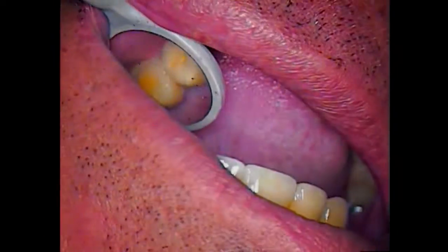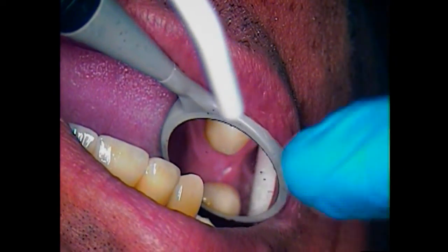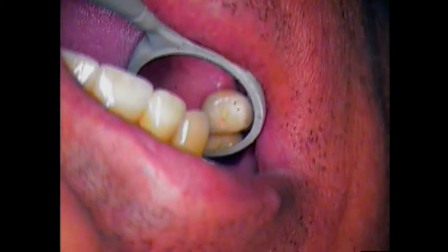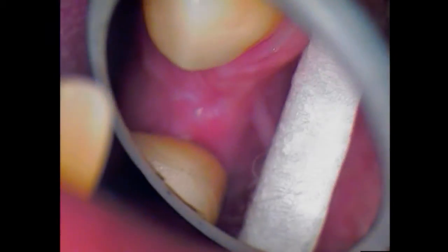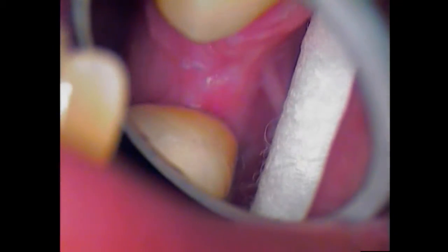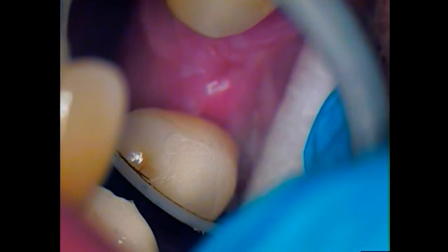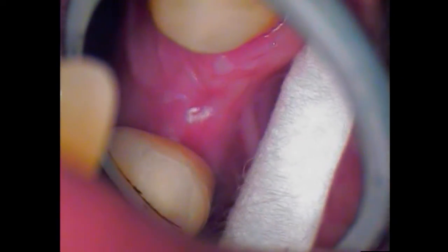We're looking right now to check relationships between the right and left sides of the mouth proportionally. Keep in mind we're going to have to gain access through the soft tissue and be very careful to identify the exact position where the implant is, conserving not only the soft tissue width but also the papilla that adjoin the adjacent teeth. Blood supply is important — keeping everything conservative.